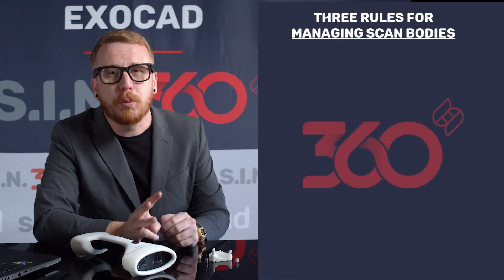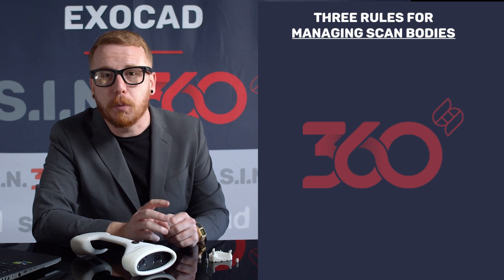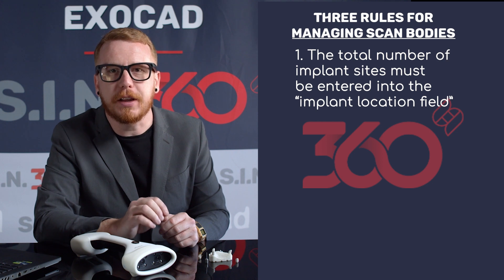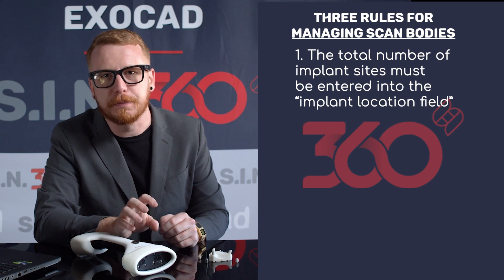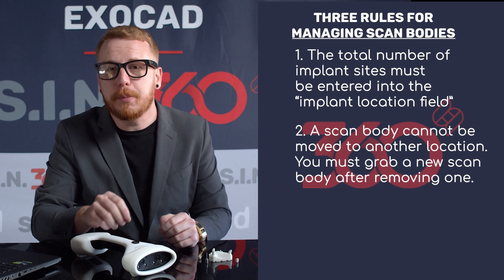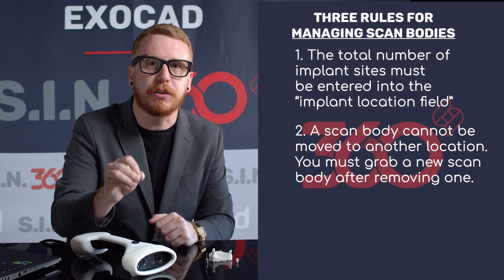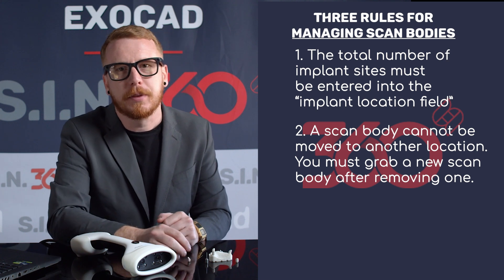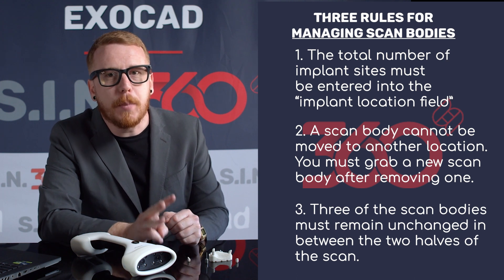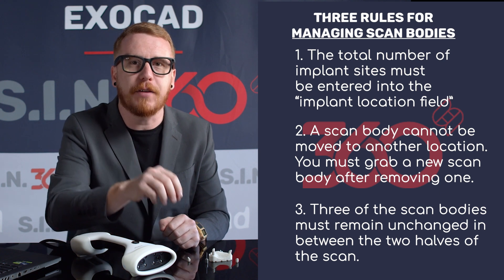Remember, there are three rules for using this function of the software. Number one, the total number of implant sites must be entered into the Implant Location field. Number two, a scan body cannot be moved to another location — you must grab a new scan body after removing one. The third rule is that three scan bodies must remain unchanged between the two halves of the scan.